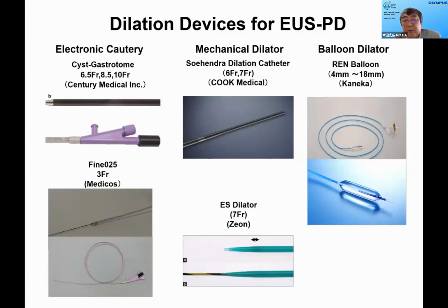This is becoming popular because there is almost no step to the guide wire. This is a very useful balloon dilator.